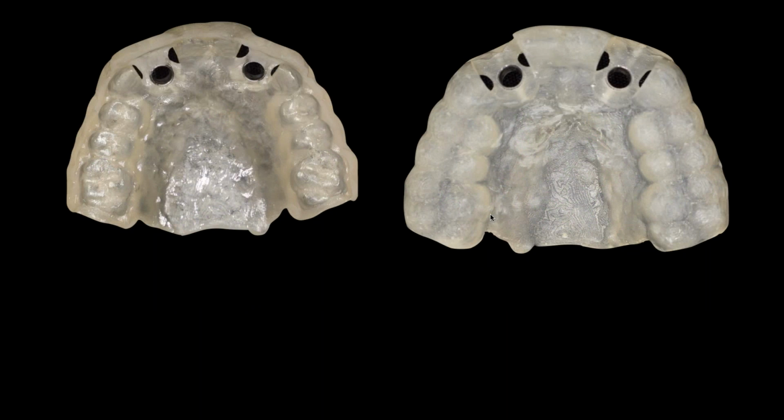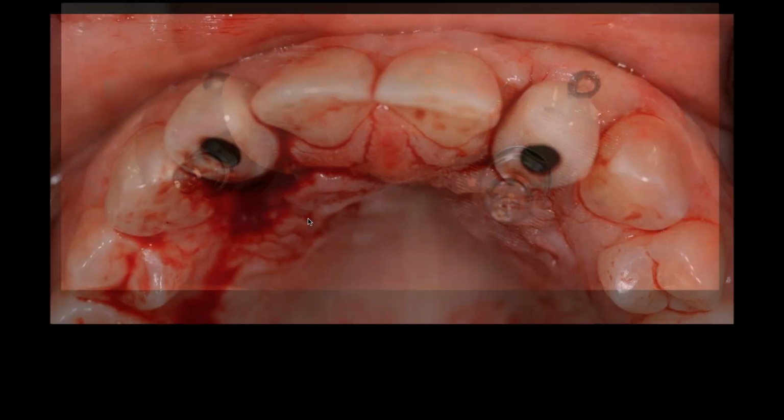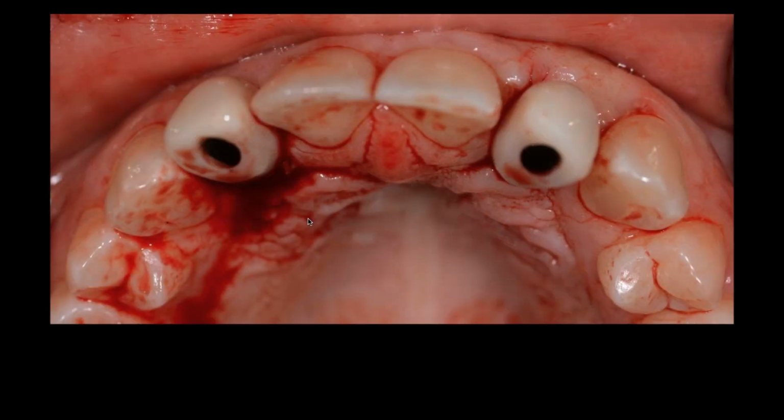Now we get the stent back, we got the sleeves for the static guide, and you can put parts in there, and the parts will allow you to then have a model that you can make a temporary, which is what we did. So here are the implants in position on her, and you notice that I have it timed. Here's the labia, and you notice it's all timed so that the flats are going out to the labial, which is important. And then the temporaries get put in. There's a little height difference because somebody didn't use the right parts or something like that.